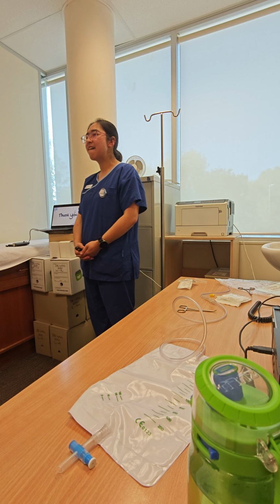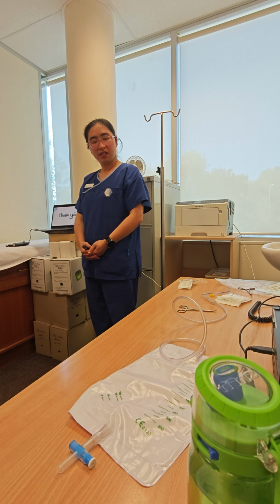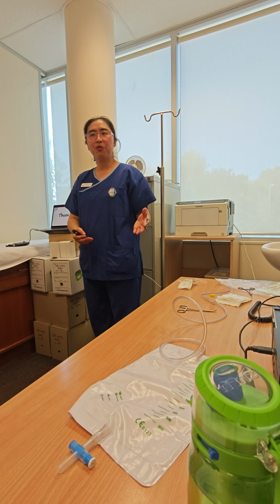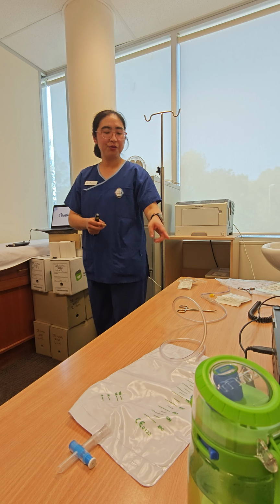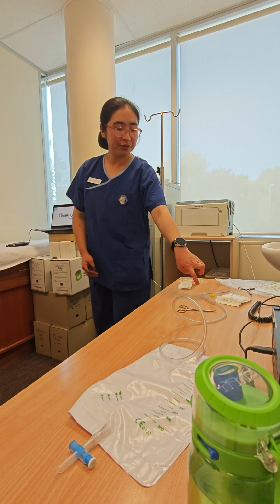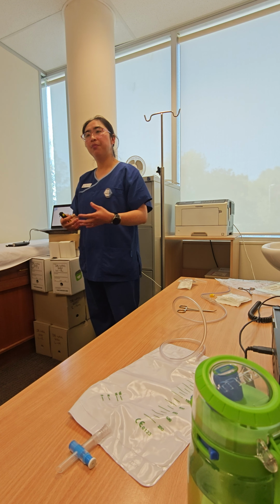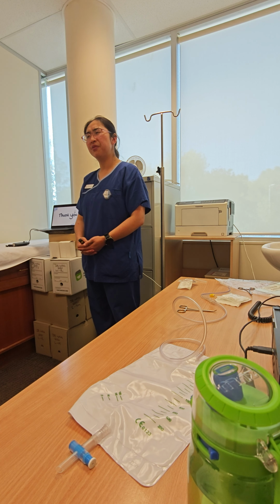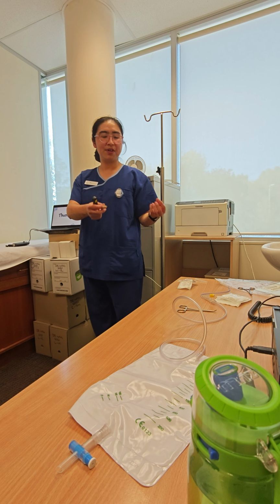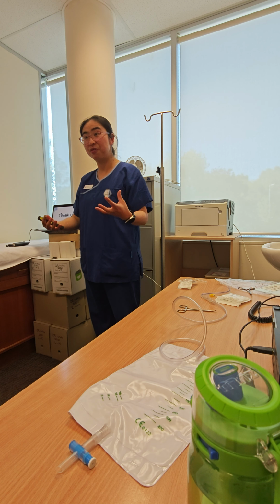Think about your equipment. Yeah, or if we do something wrong, we get bacteria through the catheter. The bacteria is going to go through the catheter into their body and cause an infection straight away. So it's very important to wear gloves and make sure all the sterile parts are really sterile.